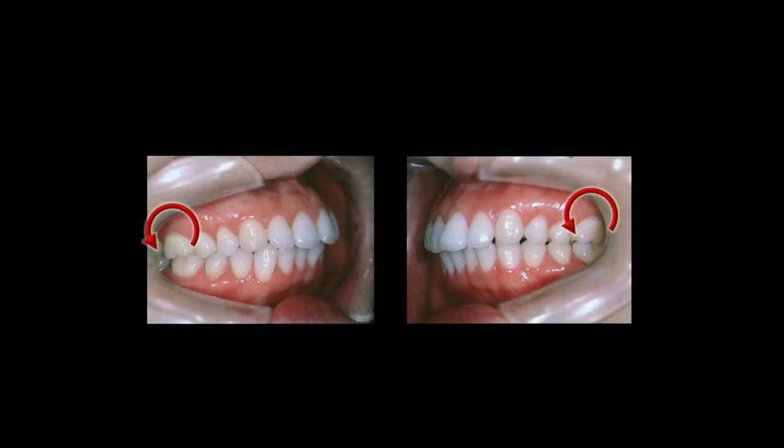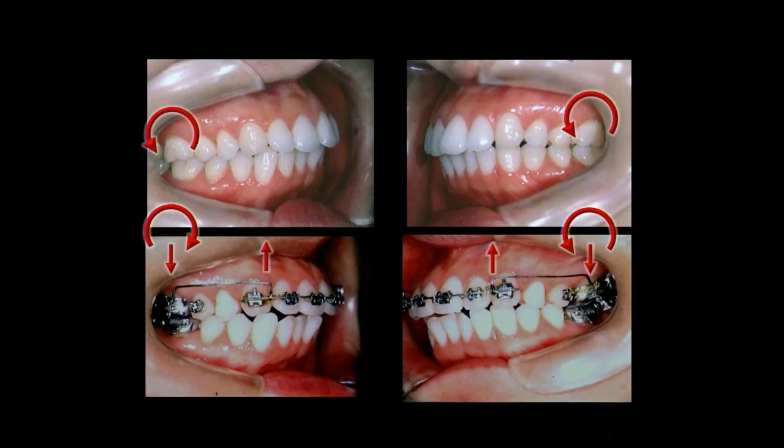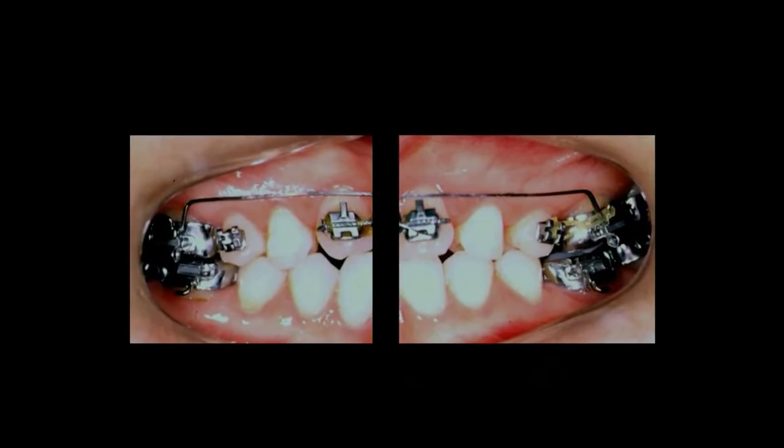This is the force system from the lingual arch in the palatal side, which is not shown in this slide. In the buccal side, bilateral tip-back spring was used to cancel the unwanted mesial tipping moment on the right side, so that only the left molar is tipped distally. Once again, the type of tooth movement that is indicated is usually movement along the arch rather than skewing of the entire arch.